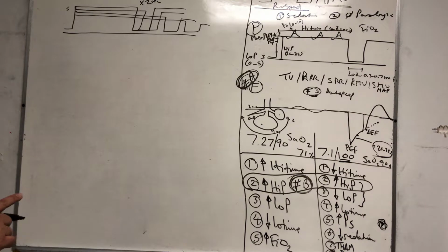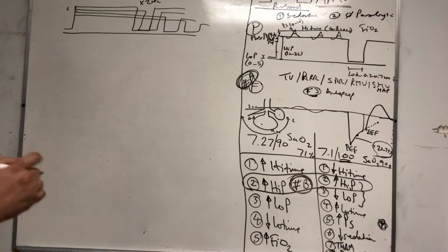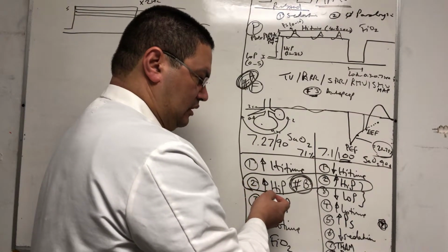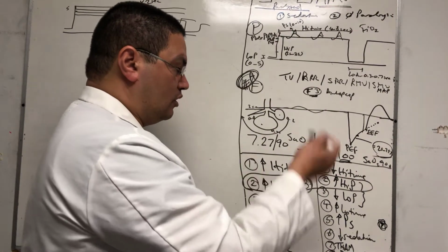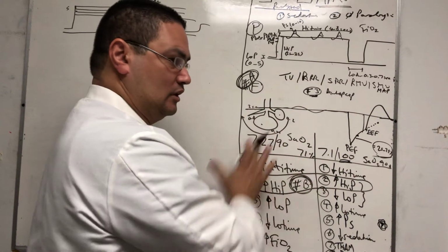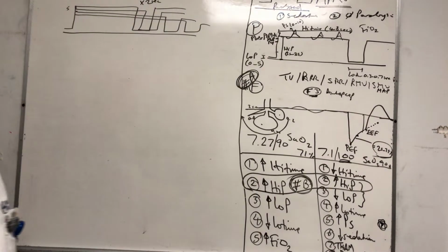The reason this is good for patients who are hypoxic is what? When you decrease the high pressure, what are you affecting? You're affecting oxygenation and ventilation, both, decreasing them, putting stress on them, right? But when you're prolonging the high time, you're further improving oxygenation, so you're neutralizing the effect on oxygenation, and further reducing ventilation and depending more on efficient ventilation.